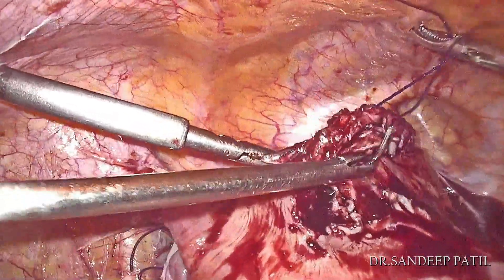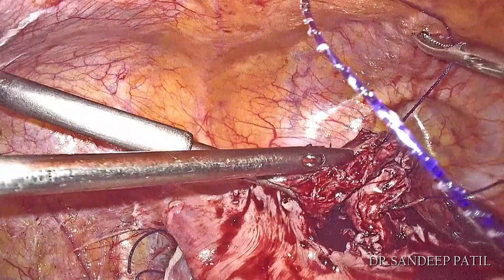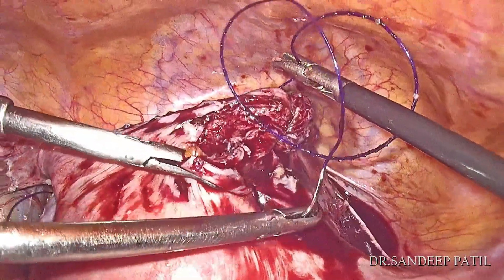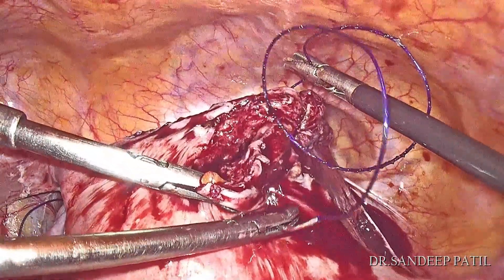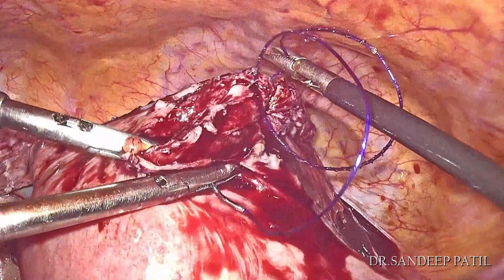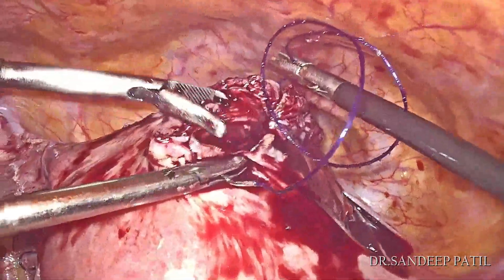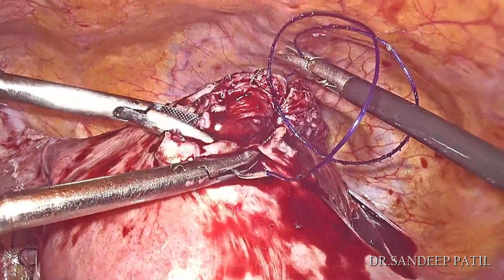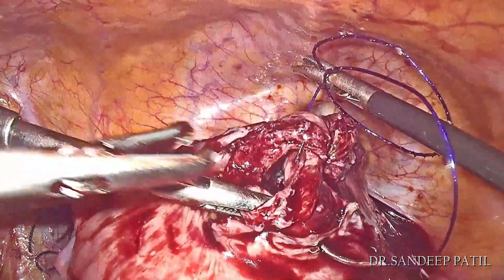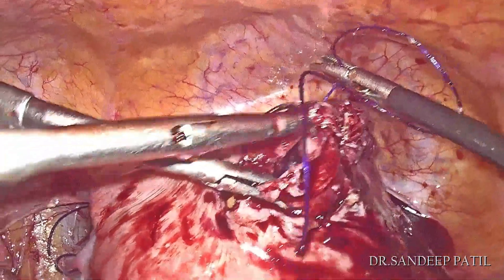V-lock sutures cause less tissue trauma since there is no need for knots, which can sometimes cause irritation and additional tissue damage. This can contribute to enhanced healing and reduced post-operative pain.